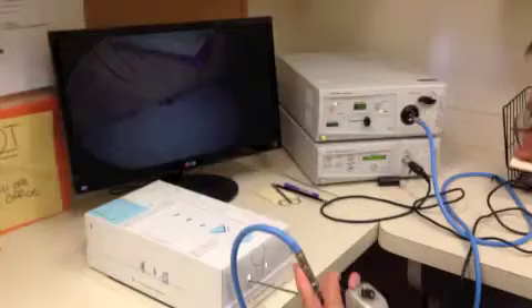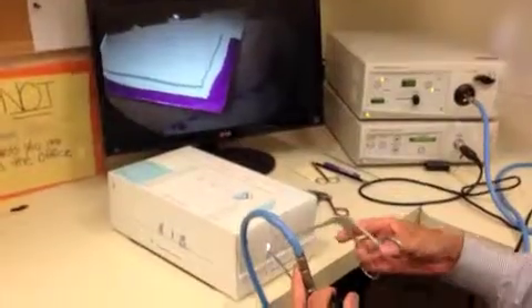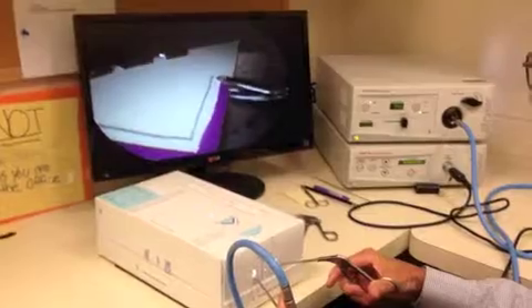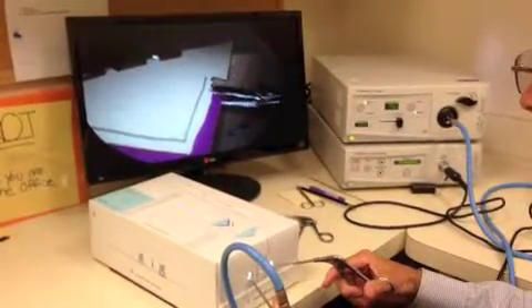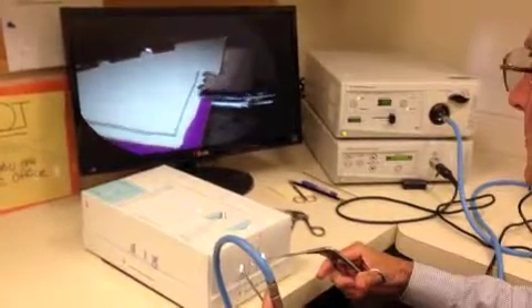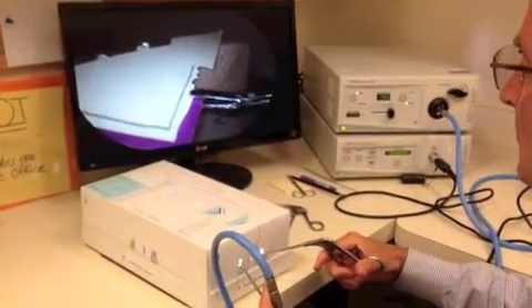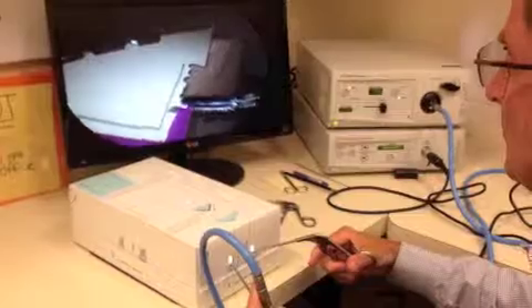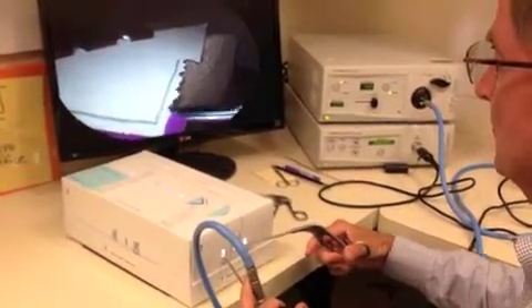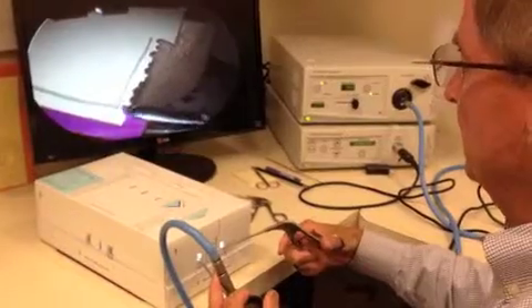First we're going to start out looking in the box, and here we have a simulated meniscus. So we're going to come in with the right hand and start resecting the blue line, trying to leave the pencil line.